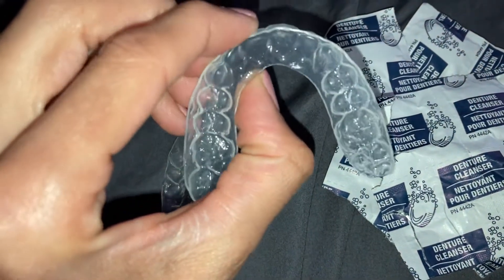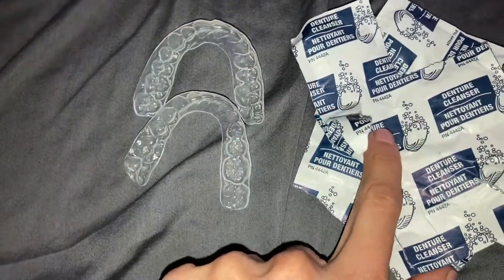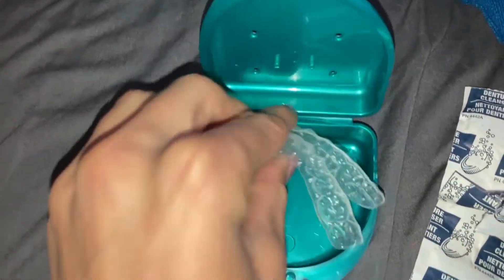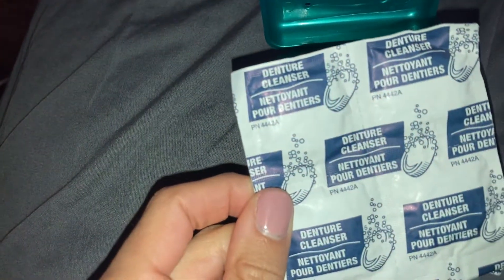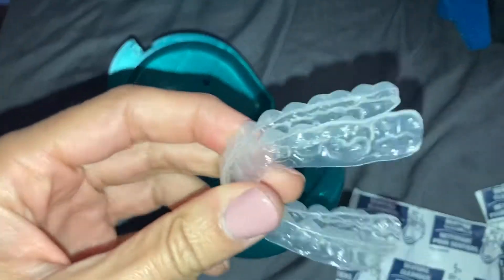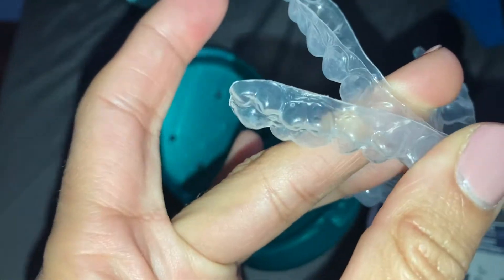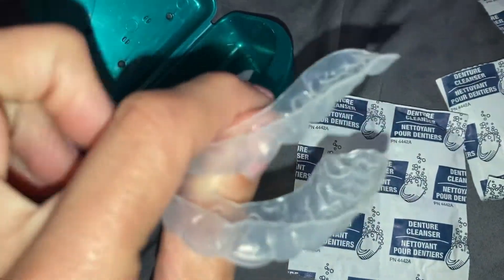If you choose to do this every day, make sure you do not soak them for more than 15 minutes — 10 at the most. Use warm water, more water than tablet. You can literally use the little case your retainers came in: plop them in there, fill it up with water, and drop one of the tablets in. When you're done, rinse them out under the sink, shake all the water off, and rinse them out really well with warm water. I still go in with a toothbrush to clean them up, because the taste of these tablets is not good at all — you do not want to taste the denture cleaner.